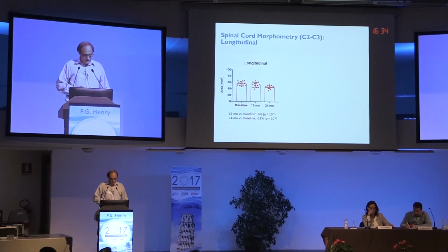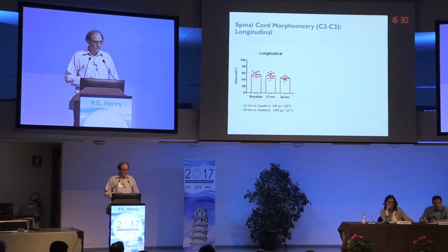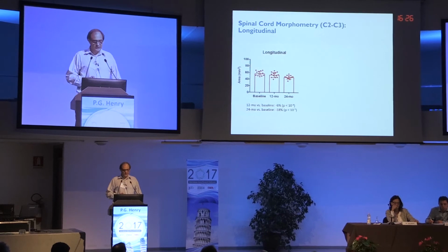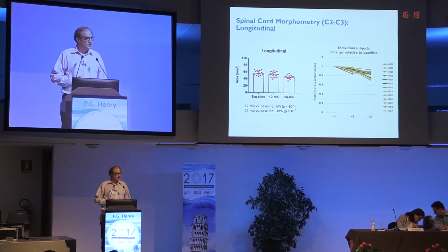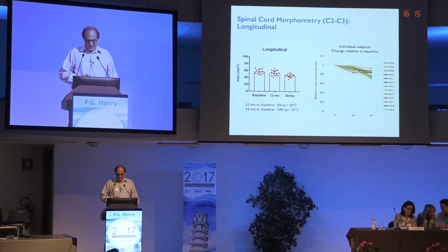And in longitudinal, we found a clear decrease over time at 12 months and 24 months, with 18% decrease at 24 months compared to baseline. And these are the changes in individual subjects at 12 and 24 months. You see all of them are decreasing over time.